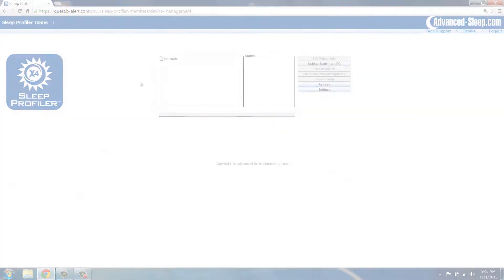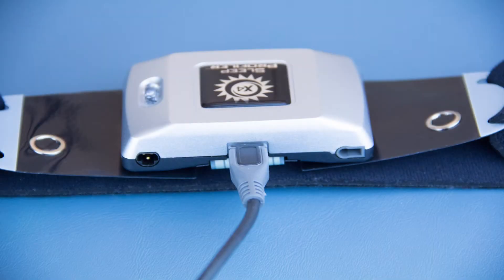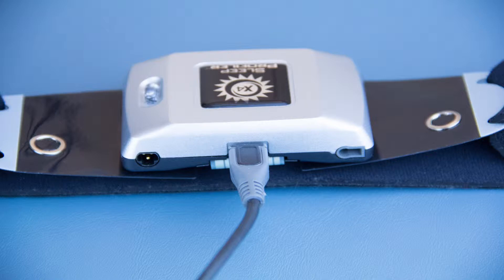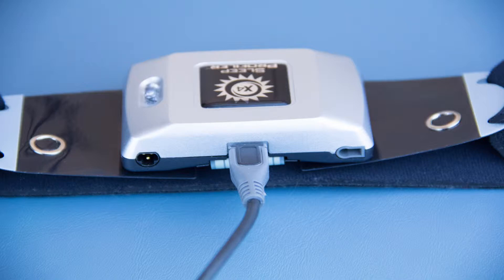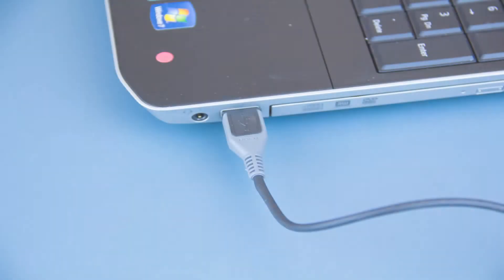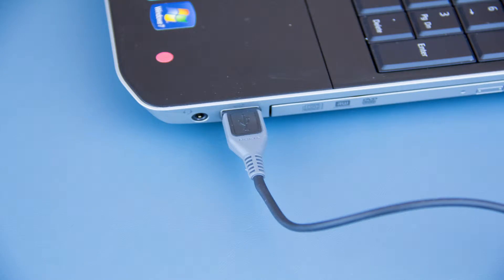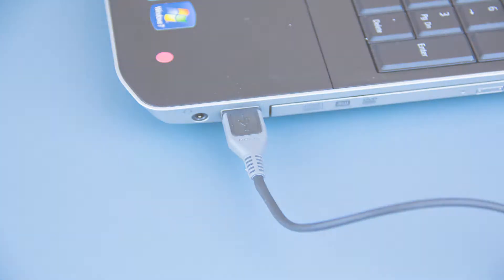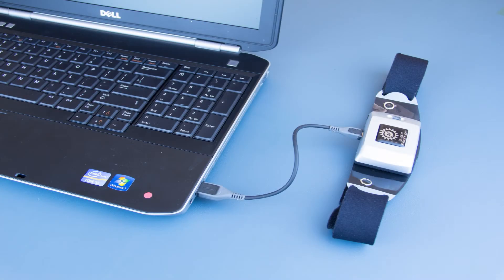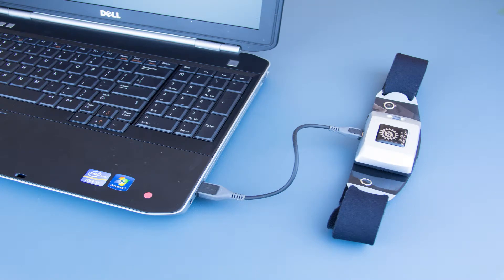Insert a micro-USB cable into the device. Do not force the cable into the connector as it may bend the connector pins and could require a repair not covered under warranty. Insert the other end of the cable into a USB connector on your computer. A voice message will indicate the device has been powered on, warning the device is charging.